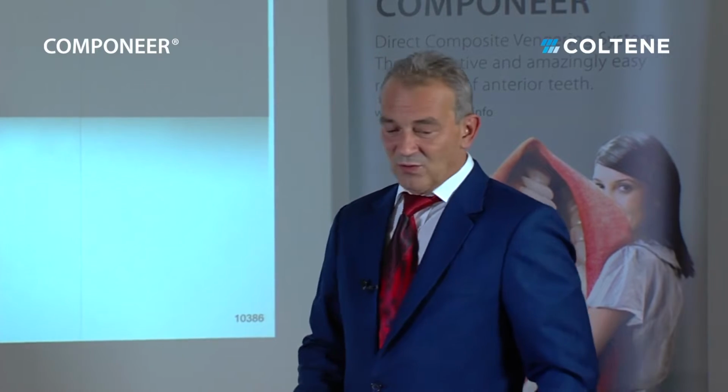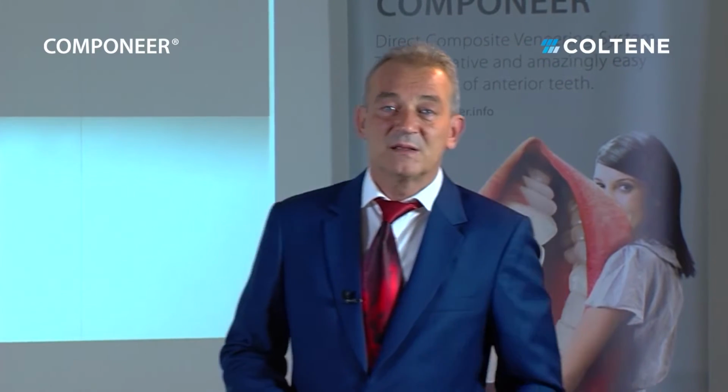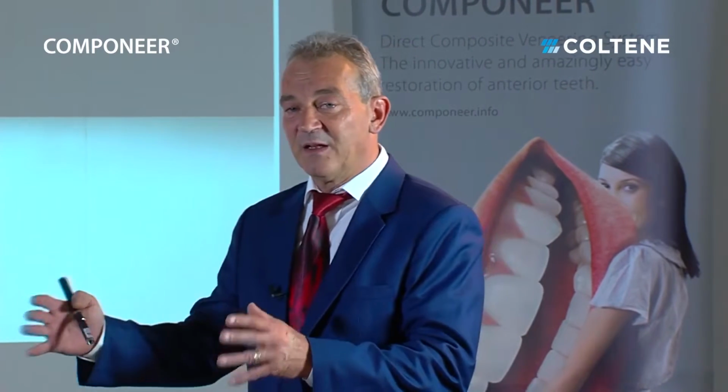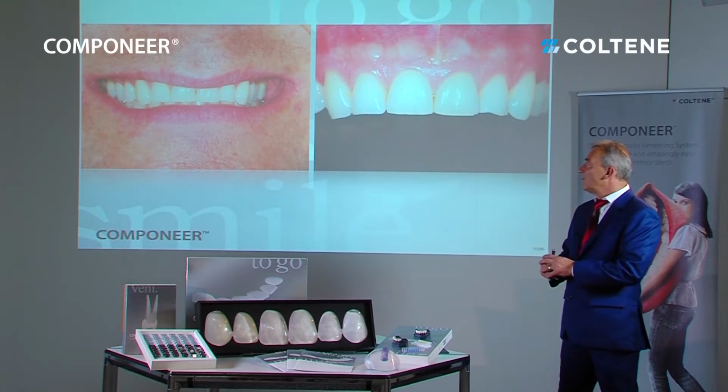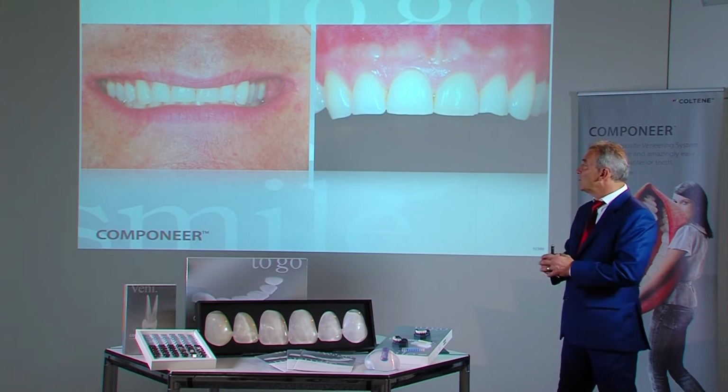This chapter covers the application of Componeer in daily routine. In other words, simple to moderately difficult cases, how, where, and why we reached our objectives.